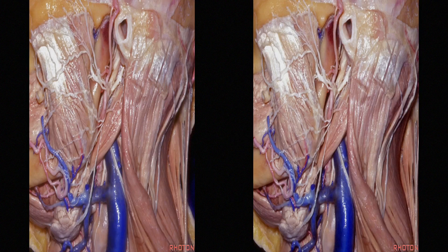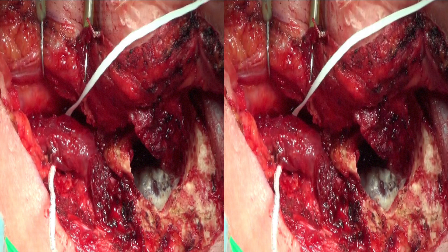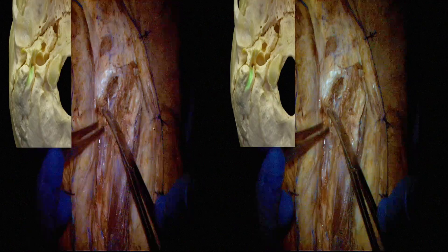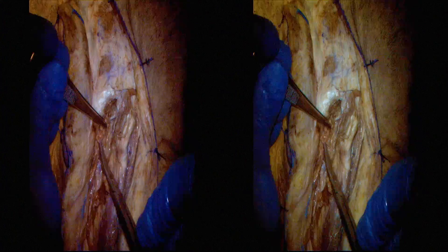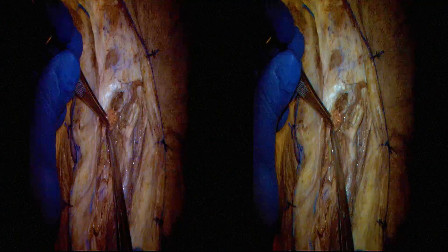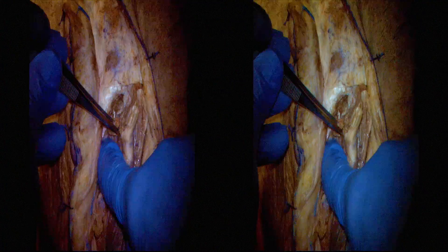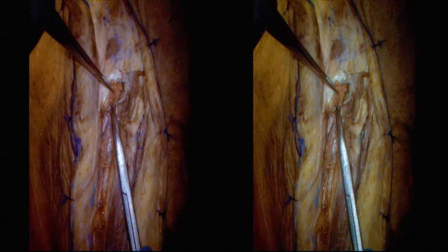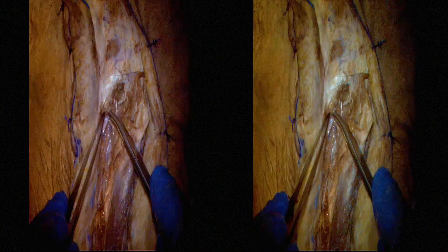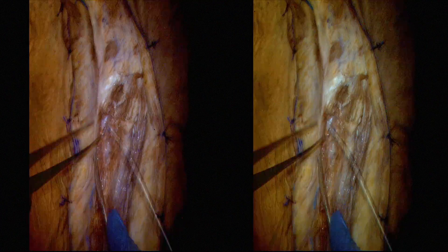The posterior belly of the digastric has been isolated with a vascular loop and is sharply dissected from the digastric groove of the mastoid tip, then mobilized inferiorly. Removal of the posterior belly of the digastric from the digastric groove allows exposure of the facial nerve at the stylomastoid foramen. This also allows palpation of the styloid process and the three small muscles attached to the process. The stylomastoid foramen is found at the posterior lateral margin of the styloid process base.